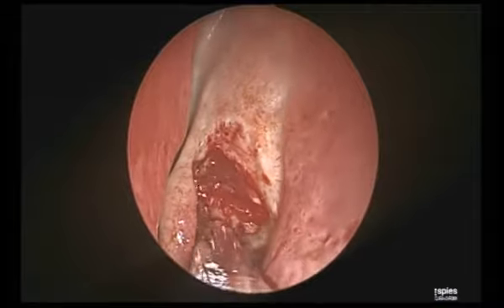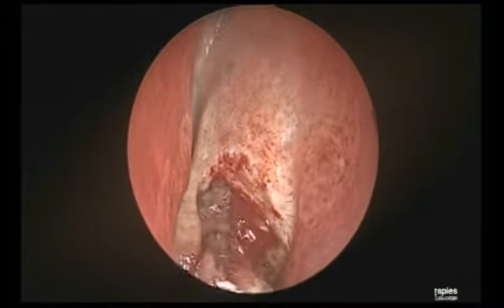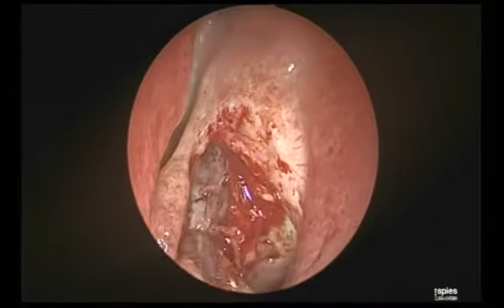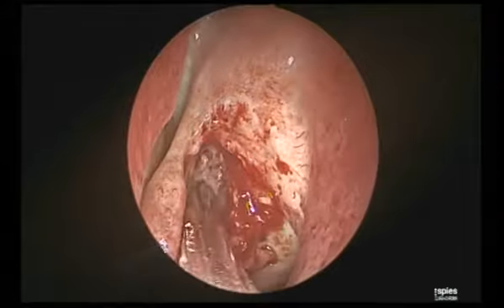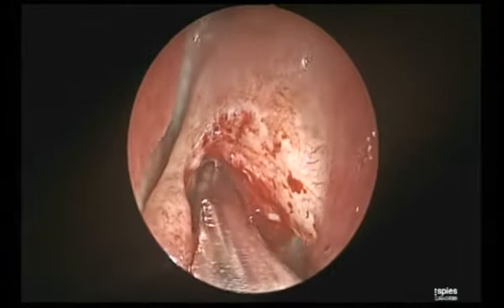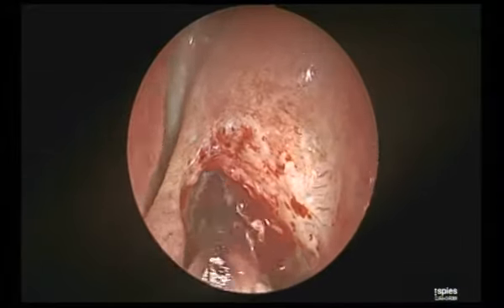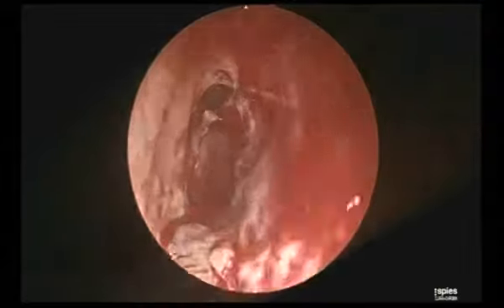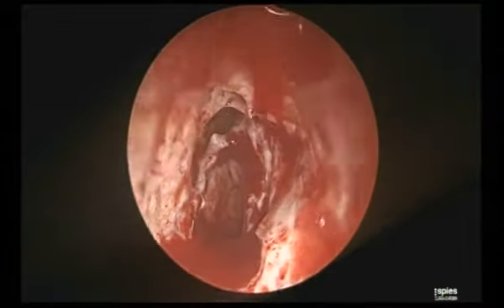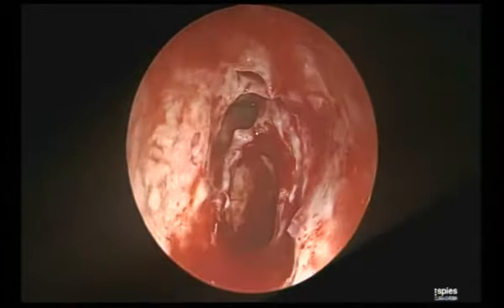You are with a 60 blade and a 70 degree scope, looking up. You have fractured the agger and debrided the medial wall of the agger. I have fractured the medial wall of the agger. I am staying just lateral to the middle turbinate. I have fractured this agger and can remove it in many ways. What you see already is the middle turbinate.